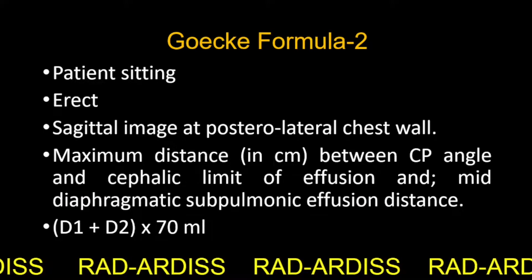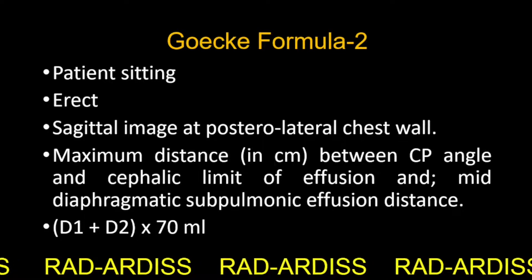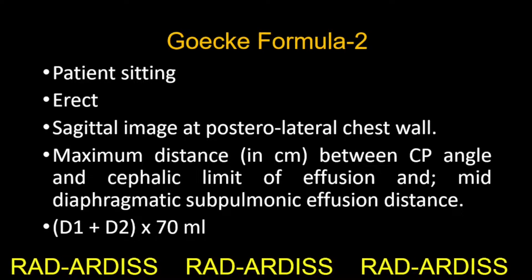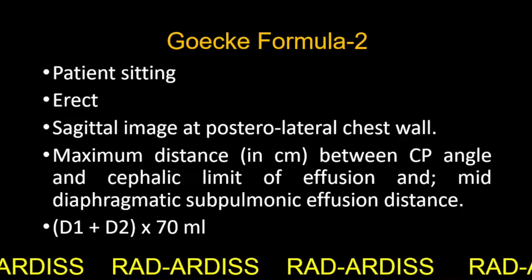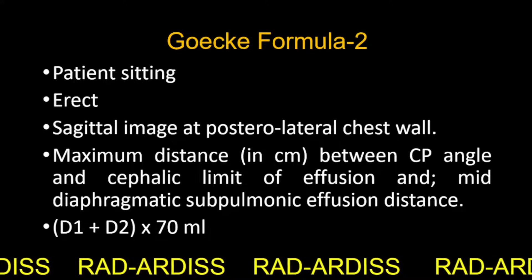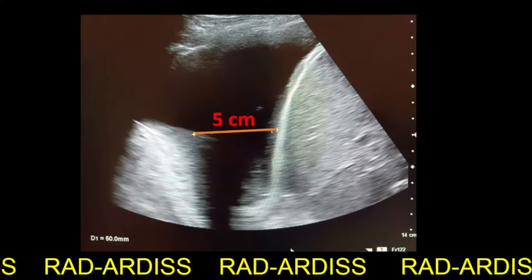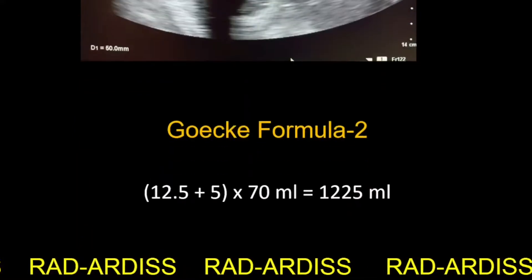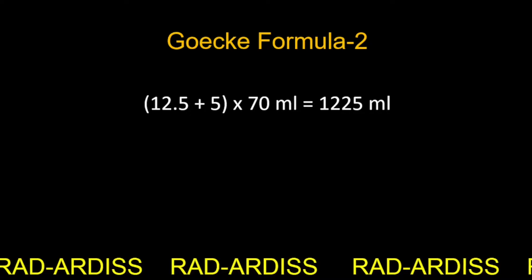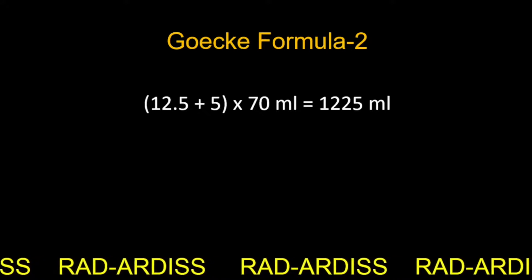Proceeding to Goiki formula number 2. Here also the patient is sitting in the erect position and the sagittal image is taken at the posterolateral chest wall. The maximum distance between the CP angle and the caudal limit of effusion at the base of the lung is measured in centimeters, and the mid-diaphragmatic subpulmonic effusion distance is also measured in centimeters. Both are added up and multiplied by 70. In our case, the mid-diaphragmatic subpulmonic effusion distance is approximately 5 centimeters, giving a total of 1225 ml. According to the literature, Goiki formula number 2 is the most accurate formula amongst these three.